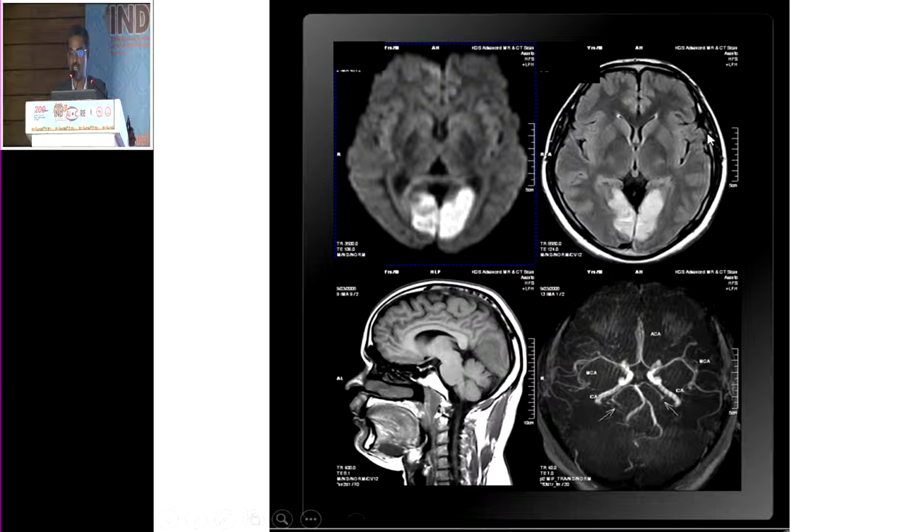You can see the normal MRI sequence, you can see all the details very clearly, whereas in the diffusion weighted images, you are not able to see the other structures of the brain clearly, but what you see only is the bright or hyperintense signals in a hyperacute infarct. So whenever a patient comes within 2 hours saying, I cannot see on this side, and you see a homonymous field defect, rush the patient to do a diffusion weighted imaging and immediately send the patient to the neurologist to thrombolyze, and that is the value of diffusion weighted imaging.